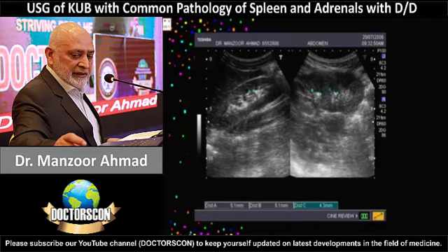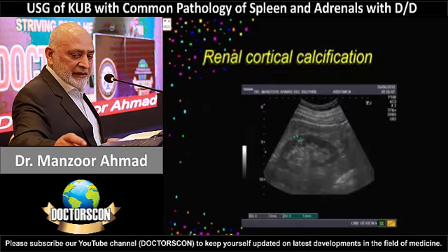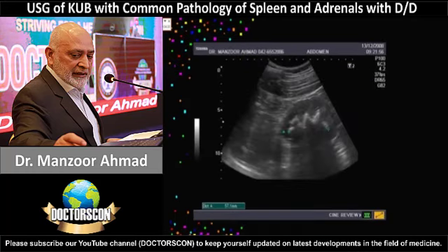They are placed within the pelvicalyceal system, and if such a calcified focus is in the cortex, that is not labeled as a stone, that is renal cortical calcification, as you can see here. So an echogenic focus to be labeled as a stone which does not produce shadow should be within the pelvicalyceal system, should be brighter than the adjacent renal sinus, and should be reproducible, of course. If there are multiple echogenic surfaces with shadowing behind, that is most likely a staghorn stone.